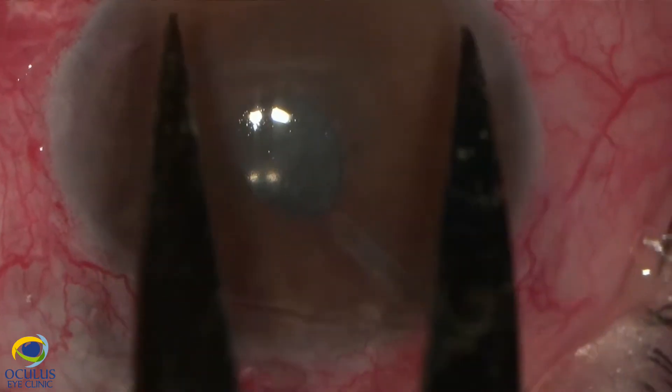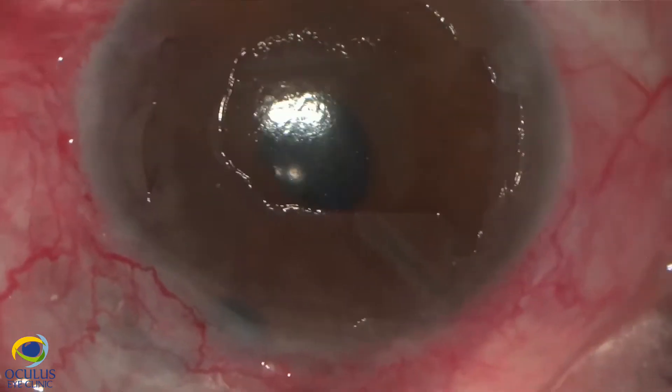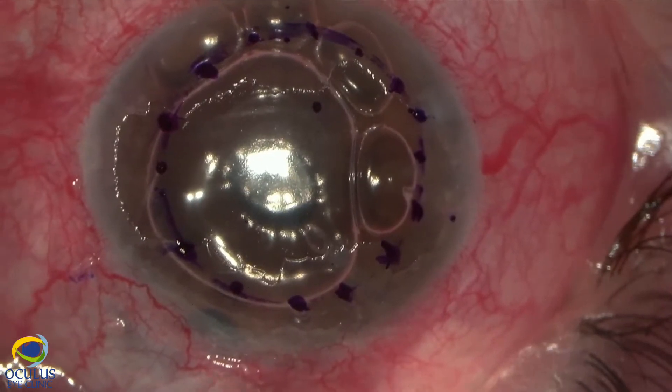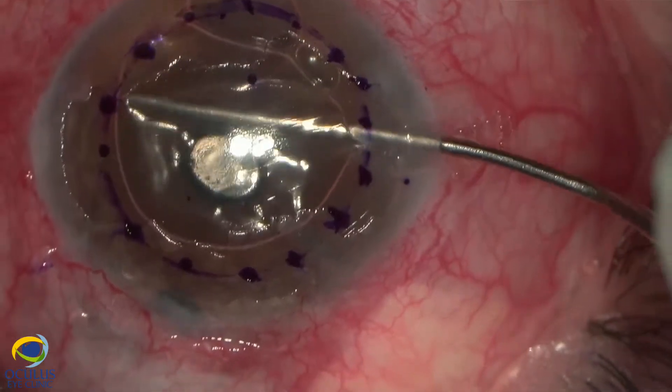We measured the diameter of the graft which will be implanted. After epithelial removal, we inject air in the anterior chamber in order to detach the synechiae in the angle, as highlighted by the yellow arrows.